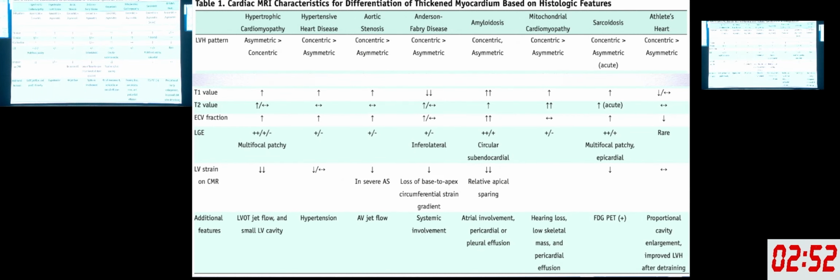So one more slide coming where photos might be useful if you want to take. So this is kind of a summary of what we are talking about. And if you look at different pathologies, okay, busy slide, T1 value helps only in one etiology in differentiating.